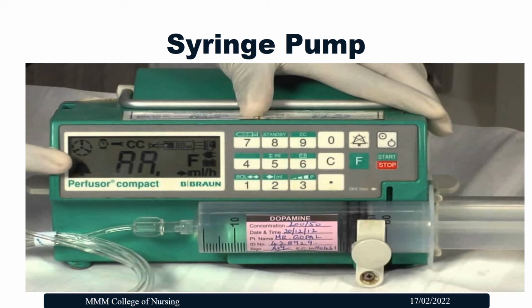Syringe pumps are electronic motorized devices that accurately control the movement of fluid from the syringe, either by mechanically inserting the piston inside or retracting the plunger outside. These pumps are used to administer a smaller amount of medication over a longer period of time in a controlled manner. It also has a setting to administer a bolus dose of medication in between when it is necessary.